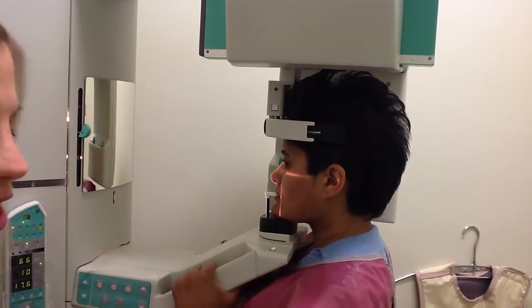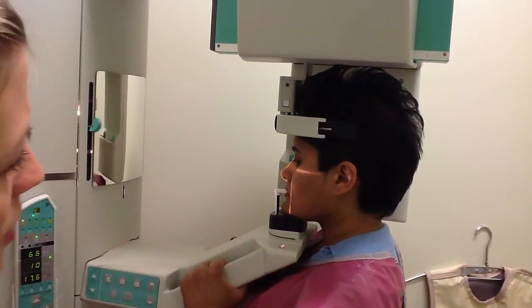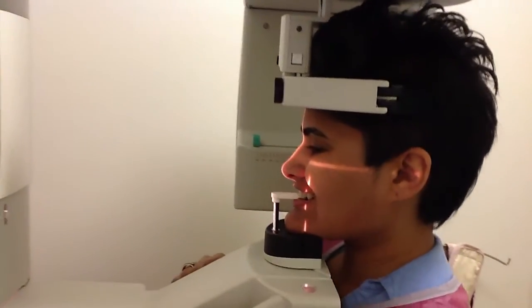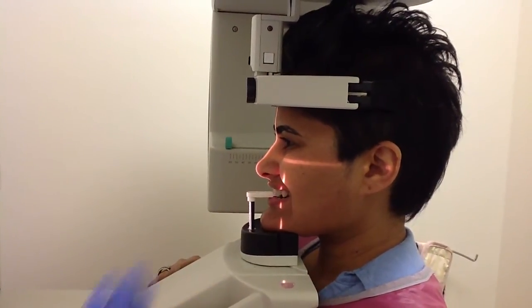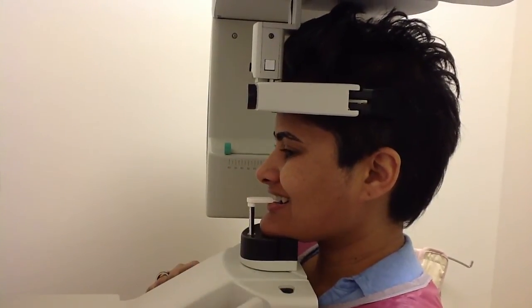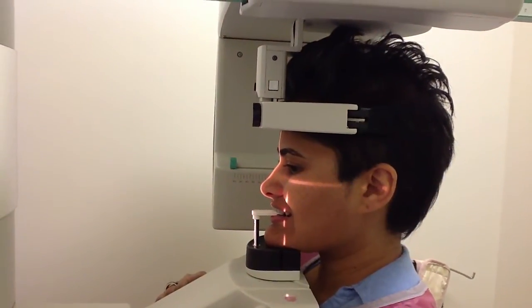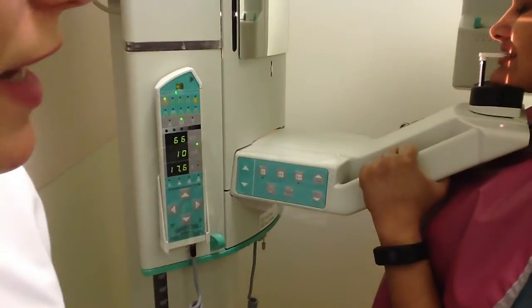Now I'm going to ask the patient to smile, keeping her teeth closed onto the bite block. What I'm looking for, I'm looking at her canine, her 3 there. I'm looking to see where that light lines up. This is her occlusion light. We want to see if it's mesial of the 3, right on the 3, or in the distal of the 3. And that is when we're going to be telling the machine where the light lines up.